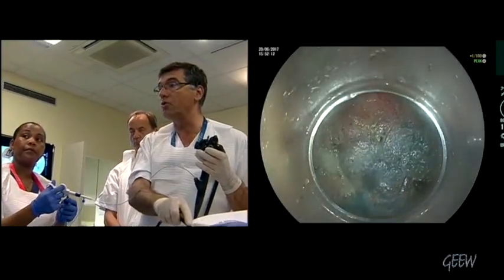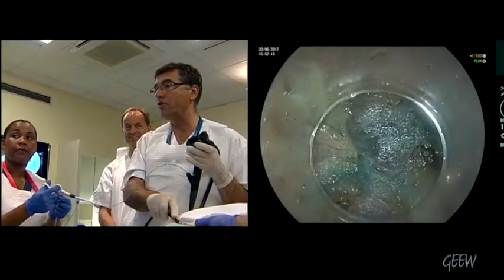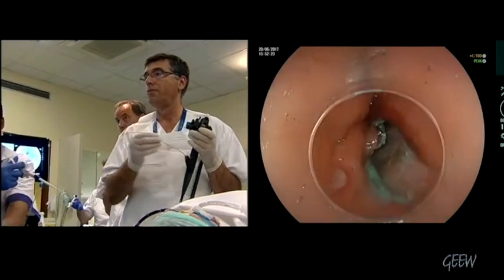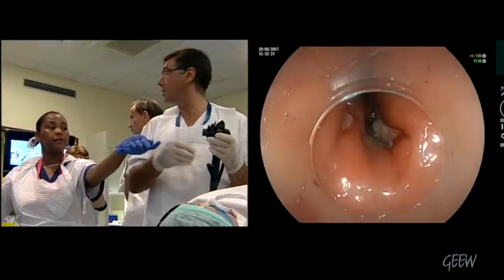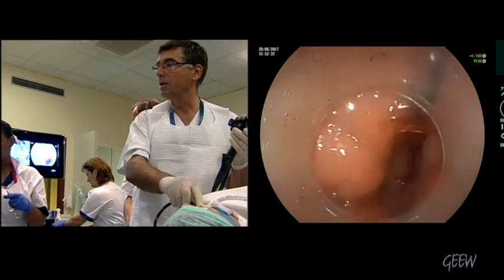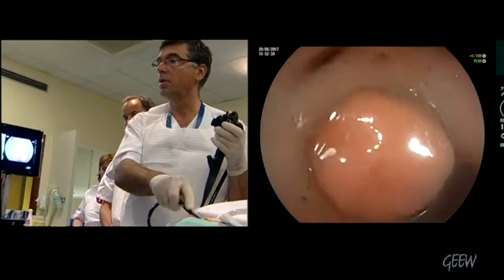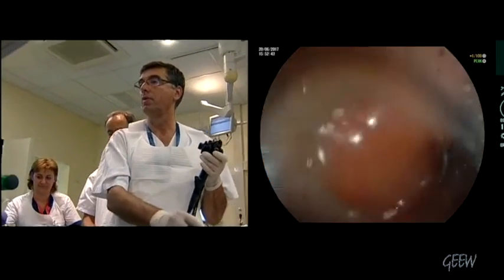Have you some questions? Are you convinced? Fully convinced. We will close the mucosal entrance with clips, of course.